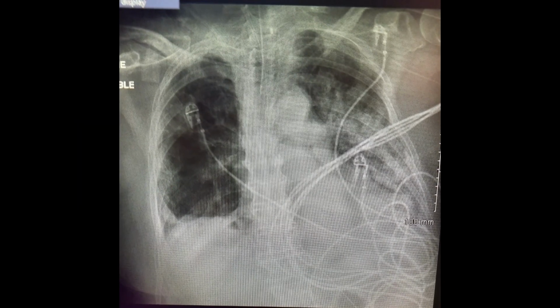So since there is a potential for distribution of ventilation in that area, we're going to try an APRV trial to see if we can recruit more with a longer T-high. If the pressure itself with a shorter inspiratory time didn't do the trick, perhaps a more sustained pressure that we can achieve with APRV could potentially open up that area. So it's worth a trial.